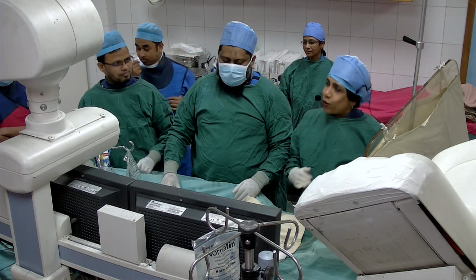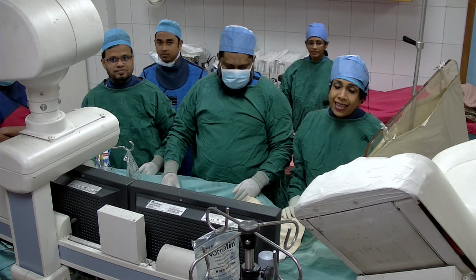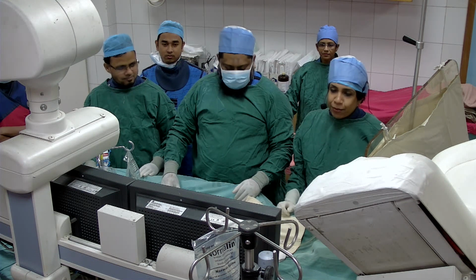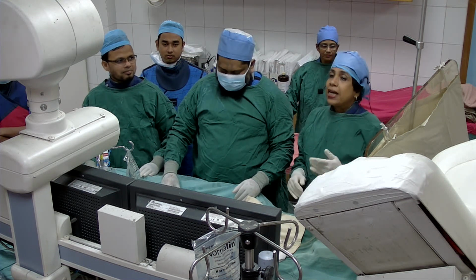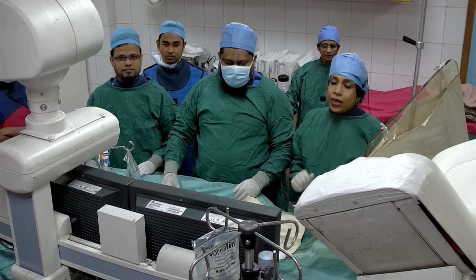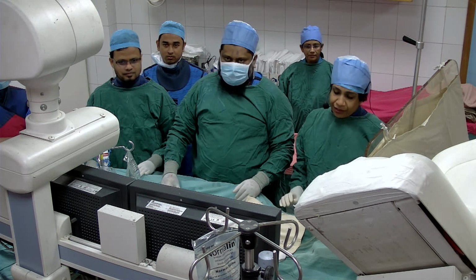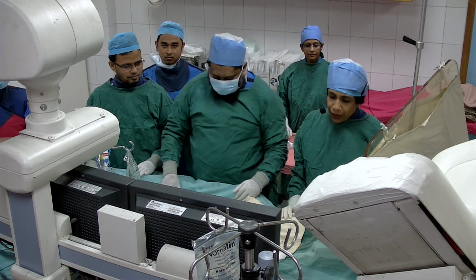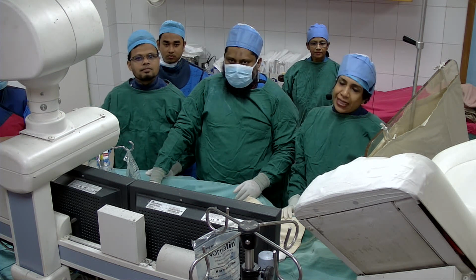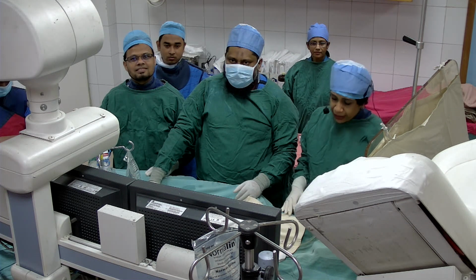so it's an OCT with angio co-registration, which is really exciting, right? You get to see all the beautiful, fantastic pictures, and you get to correlate with the angiographic picture that is happening. So it's really very cool, and we want to use this latest device. We did the first case, which was a live case to Kolkata. That was the first done in Bangladesh, and this is our second case. So we decided why not make it into a live in box case and do it.